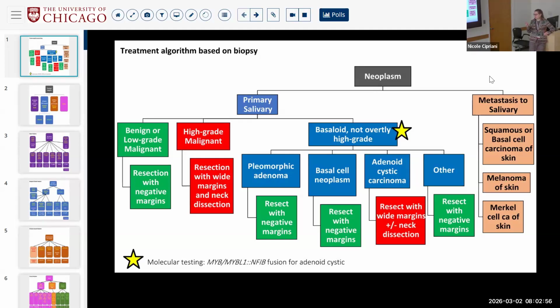You always want to determine whether something is truly neoplastic, or whether it's inflammatory, reactive. Most of the salivary gland biopsies that we're getting are neoplasms. We're not getting too many pseudoneoplasms. And so the question always then is, is it a primary salivary tumor, or is it possibly a metastasis to an intra or periglandular node? What glands have nodes in and or around them mostly? Parotid and sometimes submandibular. Usually sublingual, not so much, but parotid and submandibular, yes.